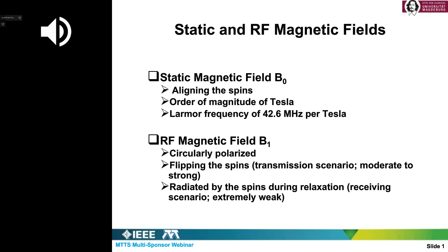It must be circularly polarized, and this circular polarization is perpendicular, in the plane transverse to the static magnetic field. It has two functions.